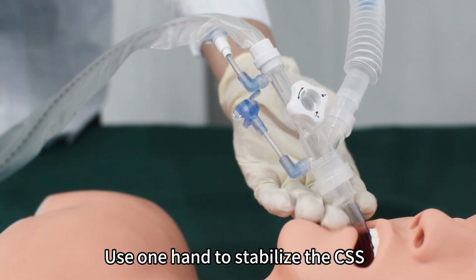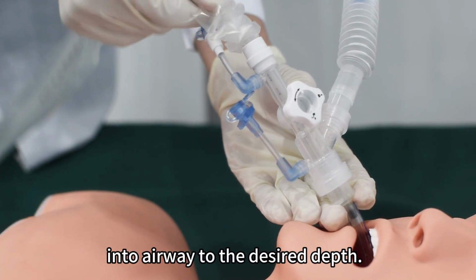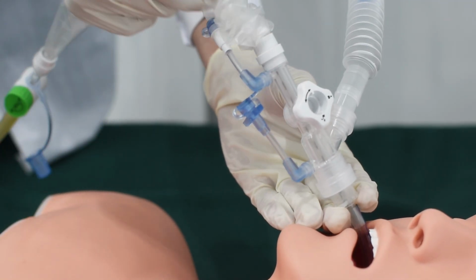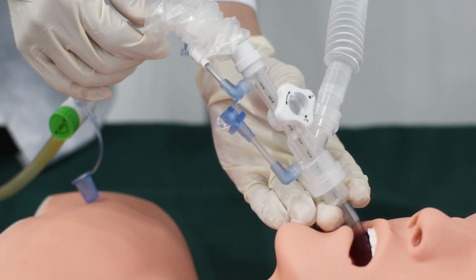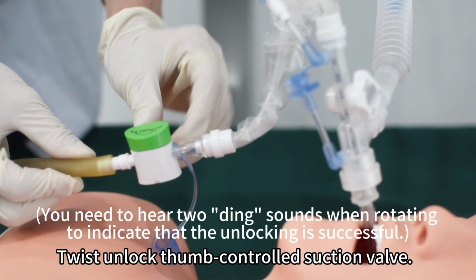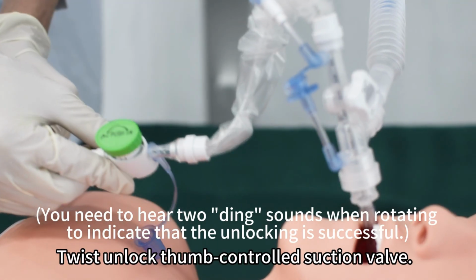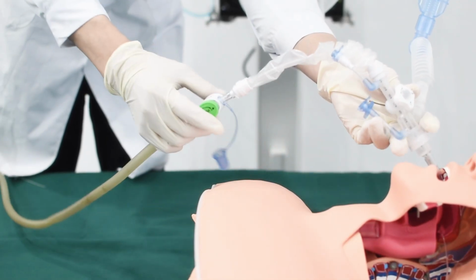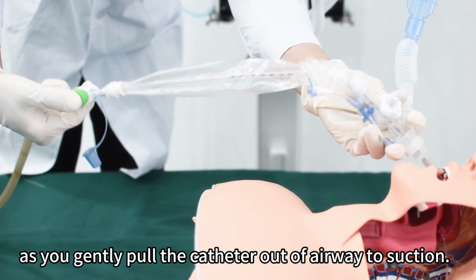Use one hand to stabilize the CSS and the other hand to slowly advance the catheter into the airway to the desired depth. Twist to unlock the thumb-controlled suction valve. Depress the suction valve intermittently as you gently pull the catheter out of the airway to suction.